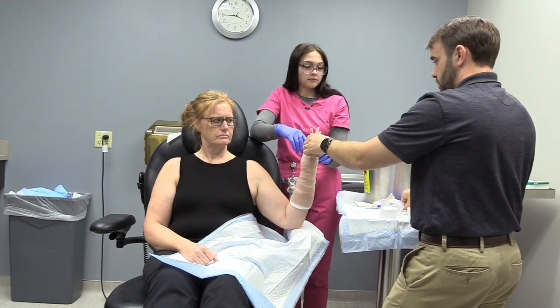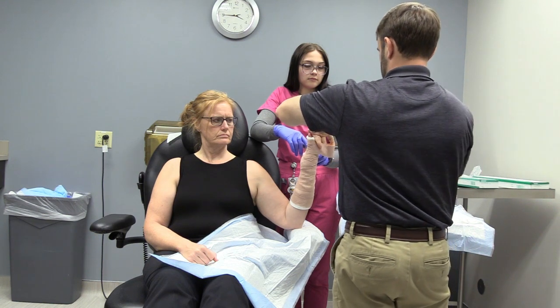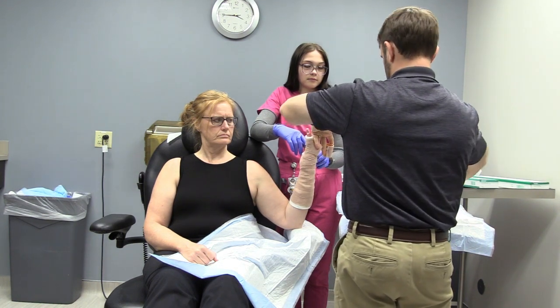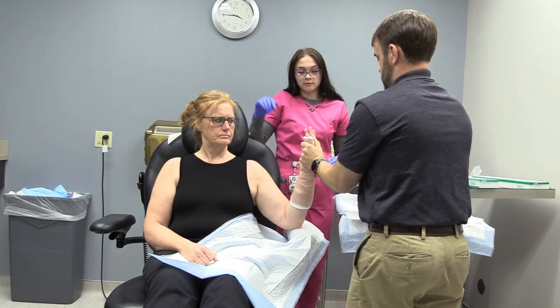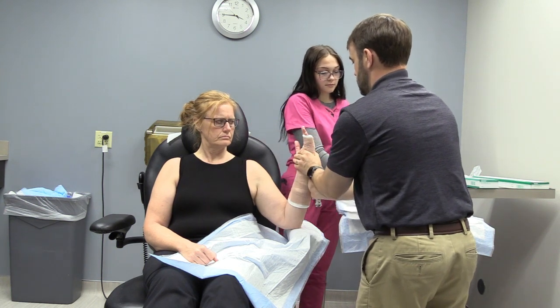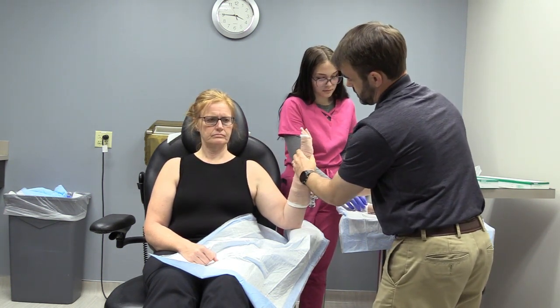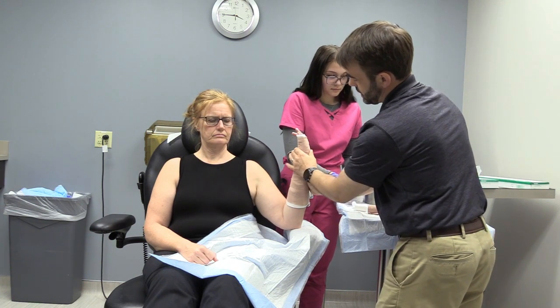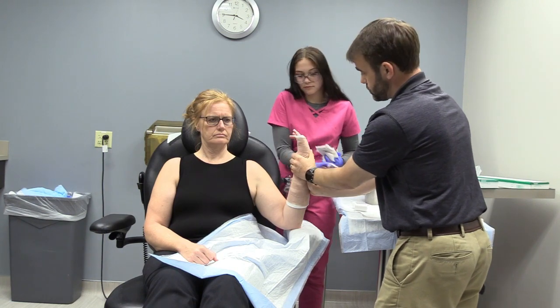Coban, you can rip it or cut it. It's a little cleaner if you cut it. And then you just have to hold them until the plaster hardens. So I'm putting it with just a little bit of extension of the wrist and a little bit of flexion of the fingers, and that'll help keep them in a more neutral position.